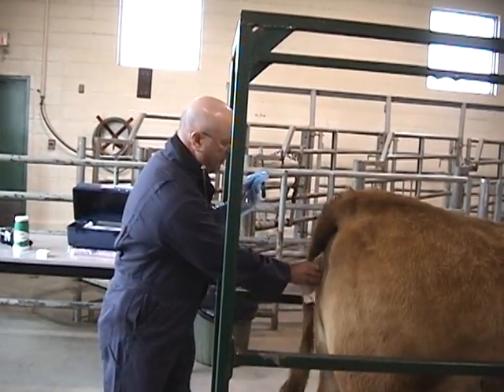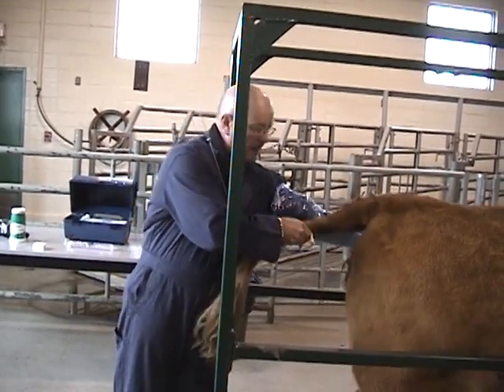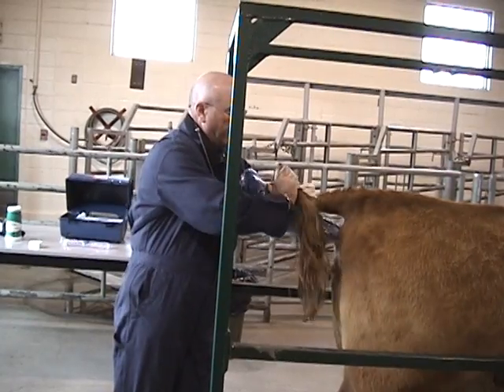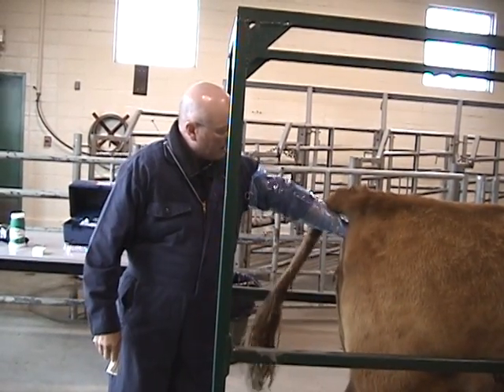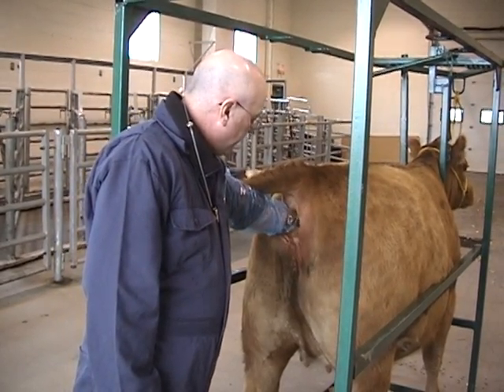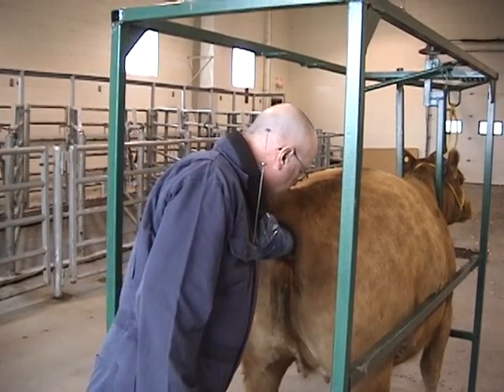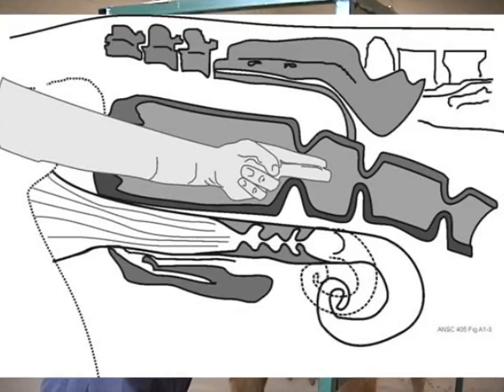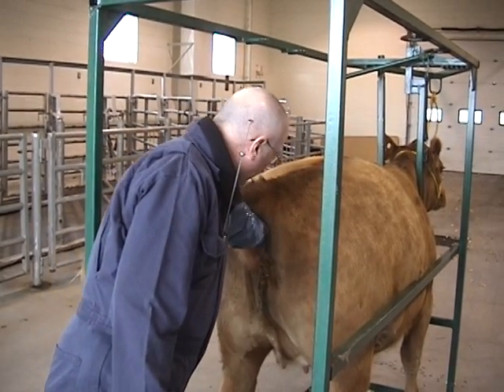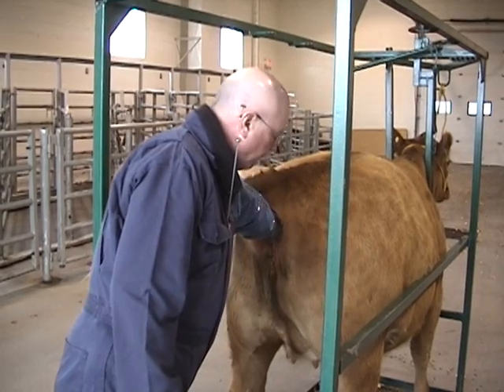I've got my paper towel in one hand. I'm going to pick up the tail, take my pointed fingers, and insert my hand into the rectum of the cow. Next, in one motion, I get rid of the tail — flip it over and block it with my forearm to keep it from getting in the way. Once I've got my hand inserted in the rectum, the cow is going to start to push back, and we're going to use the contractions in there to pull the manure back out. Once I'm pulling the manure out, I do not take my hand out of the rectum. If you pull your hand out, she's going to suck air in past your arm, which blows the whole rectum up and you don't get a good feel for the cervix.